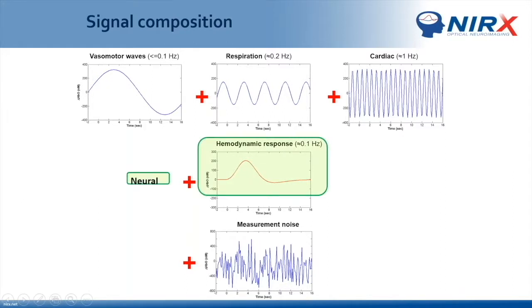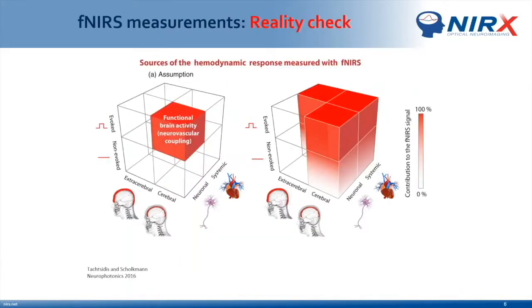So, in recap, we would like to infer cerebral changes that are typically evoked responses and are of neuronal origin. However, the signal we measure with standard channels, although it gives us a very good estimate of the neuronal response, does have several confounders embedded into the signal.